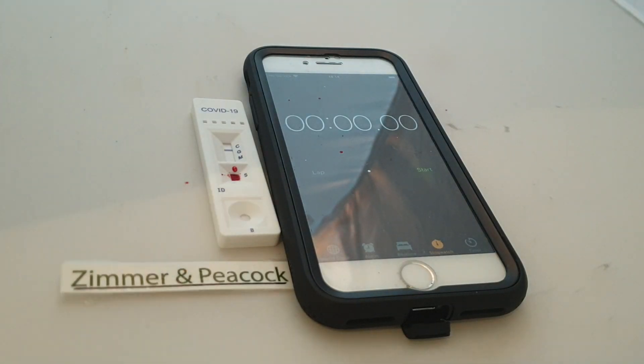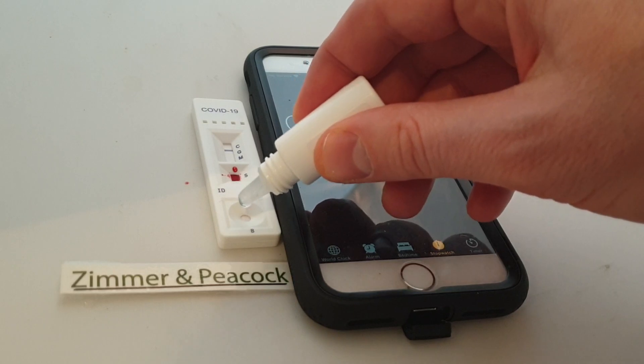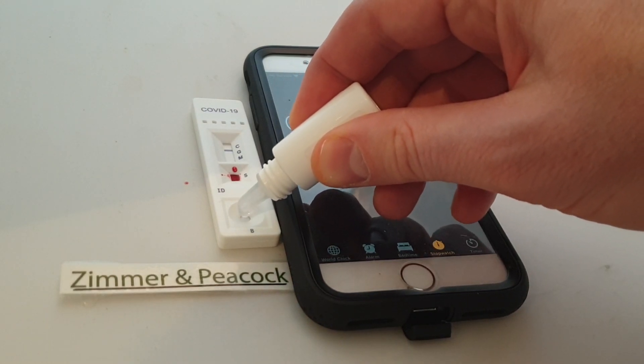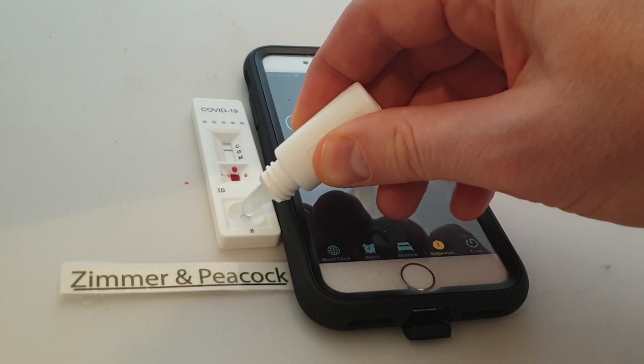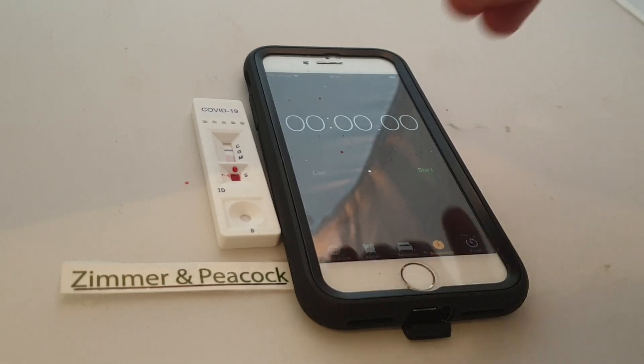Now what I'll do is I will take two drops. So this is basically a lateral flow device. I put two drops on there. And now what's going to happen is that solution that I just put on travels up the sensor, and it picks up my sample and starts carrying my sample up.